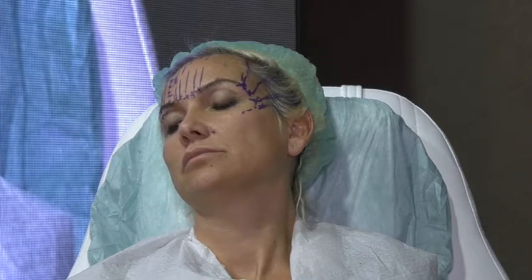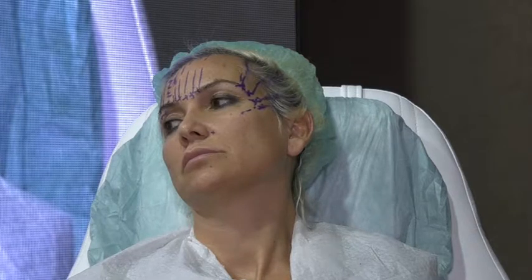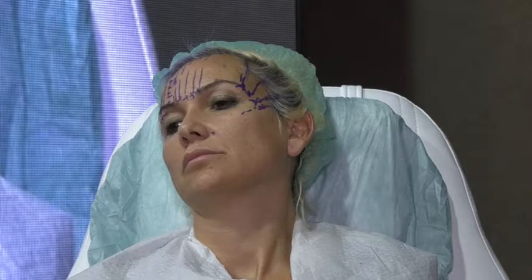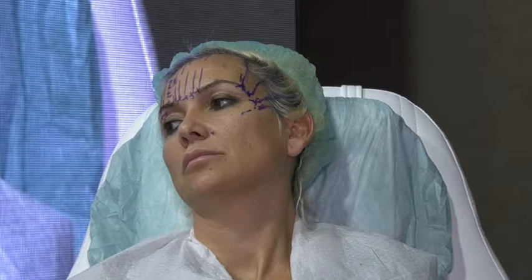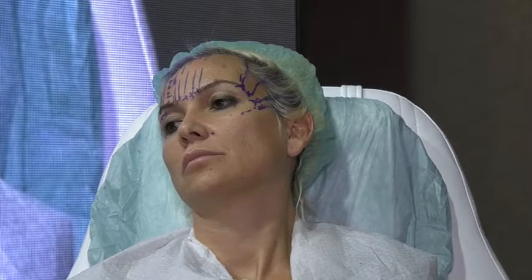Because of two reasons. Can you tell me one, Doctora? Yes, it will change the shape of the nose and the nose will be more widened. What is the second reason? Exactly, the second reason is that when I go under the eye, I will have more bruises, no fixation, and a weird shape. That's why I wait until the nose is finished, so I have a clear angle and can work properly. So my first entry point is at the base of the nose, lateral to the nasolabial by half a centimeter.